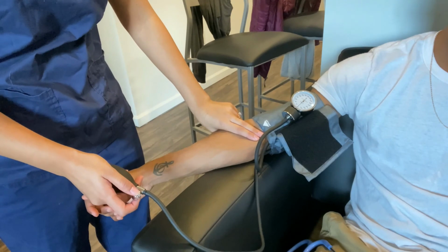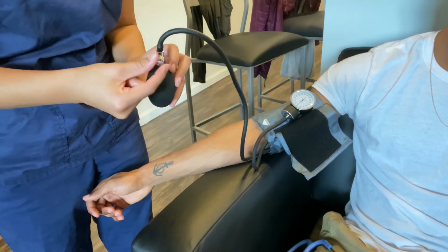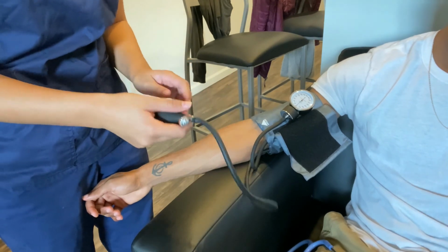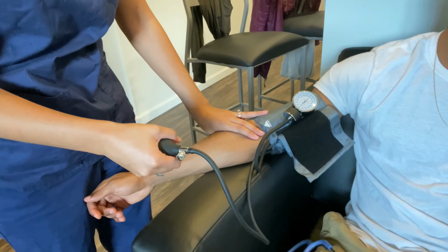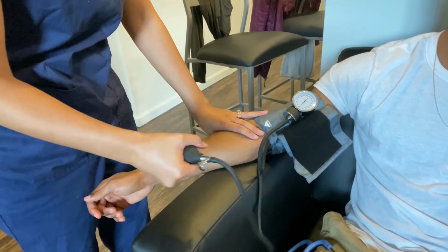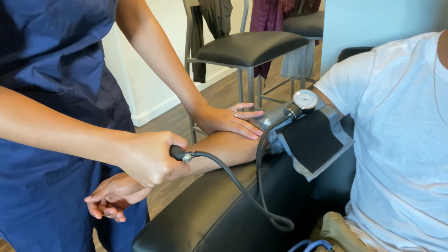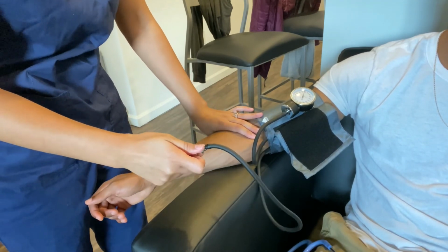So you want to feel that brachial pulse, and with the pump, you have a valve that opens and closes. So right here, I'm going to close that valve and I'm going to pump until I feel this person's pulse stop. So I'm going to look at the blood pressure cuff and I'm going to keep pumping. And in this case, it stopped at 140.